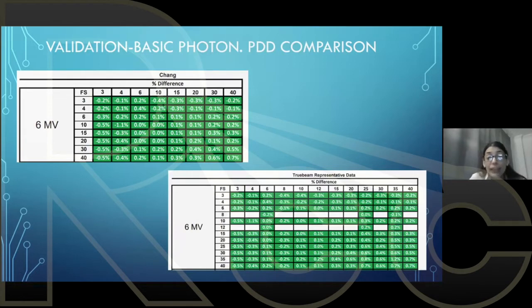In my experience, I will prefer to do all my measurements, even though it takes time. But I understand that there are some places that don't have the manpower. Sometimes you end up working in a solo physicist facility. For those places, if you have colleagues, ask them to check it for you. You need to have some type of redundancy.